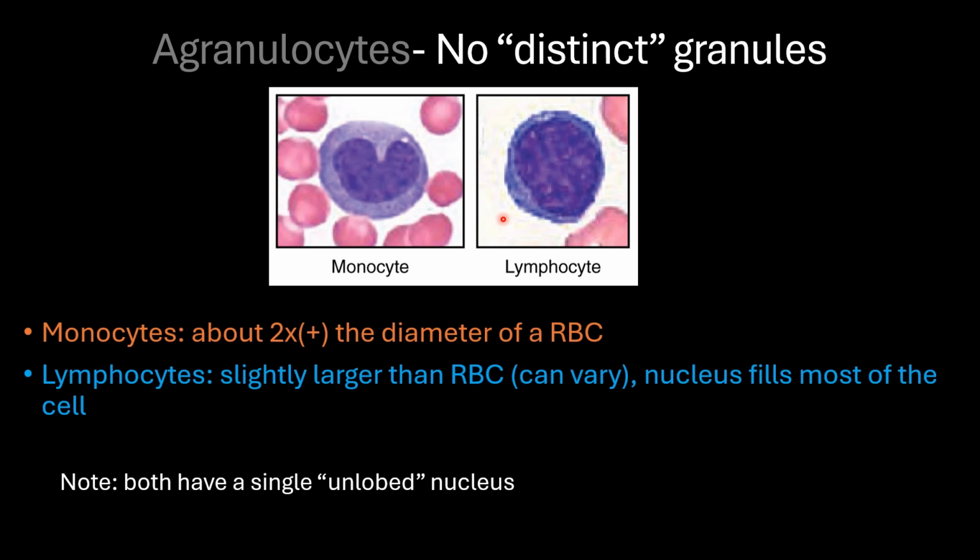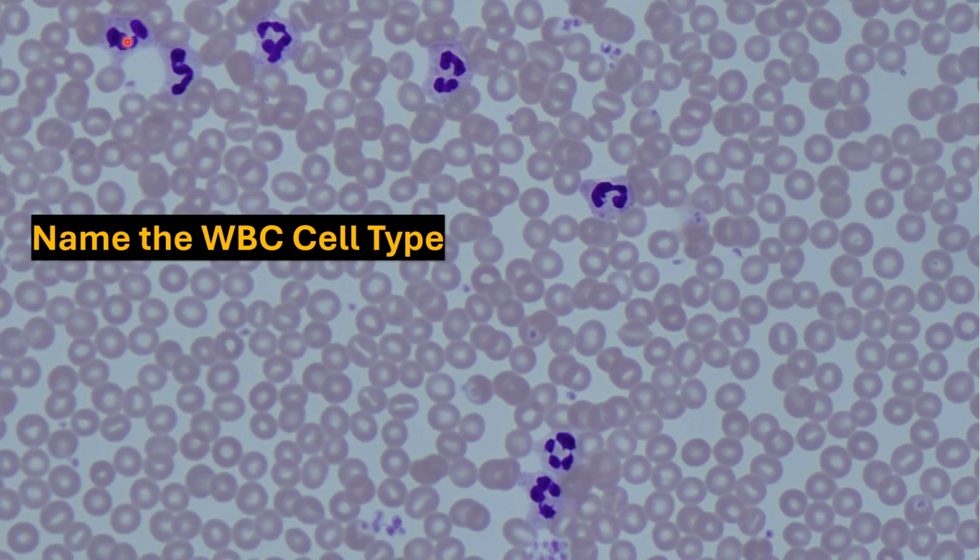So having gone over all the basics of our 5 cells, let's take a look at each cell at 400 times power magnification. So here we see 7 leukocytes that are surrounded by many more red blood cells. The red blood cells have lost their nuclei, so they appear donut hole shaped in the middle, and therefore they don't stain purple. These smaller purple dots, those are our platelets.